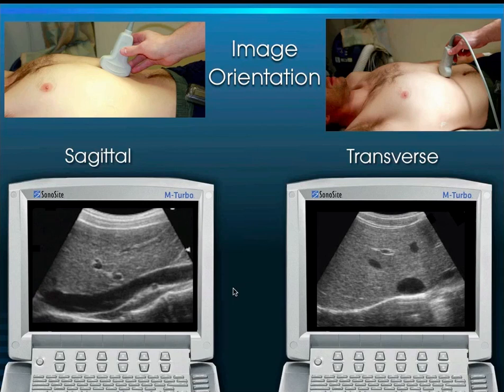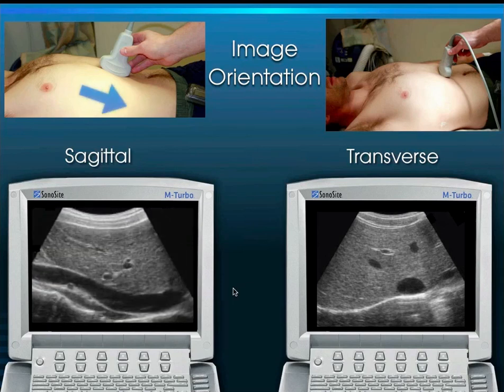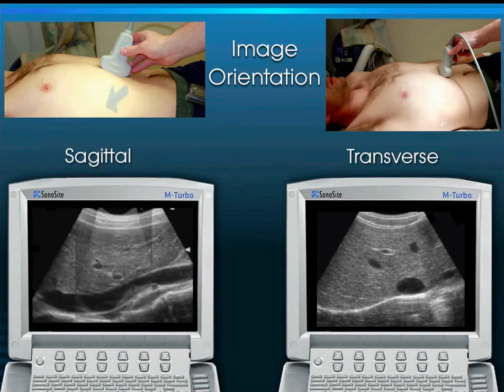But if I accidentally aim the indicator down towards the feet because I wasn't paying attention, now this IVC is upside down. And when that IVC is upside down, while you can still interpret it, it's an upside down image and goes against the convention in the United States. Over time, that appearance should feel like fingernails on a chalkboard to you. So I'm going to turn it back right now, because it's having that effect on me.